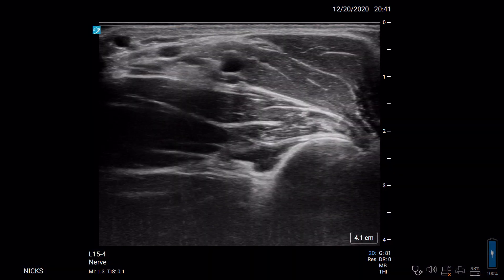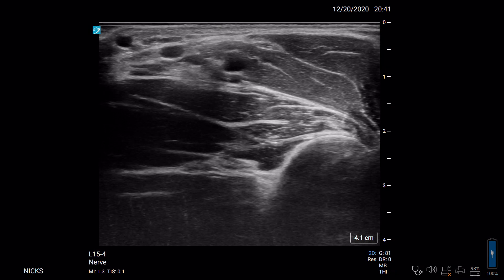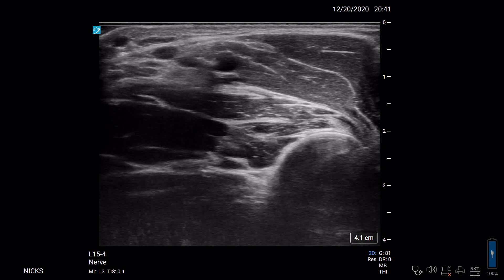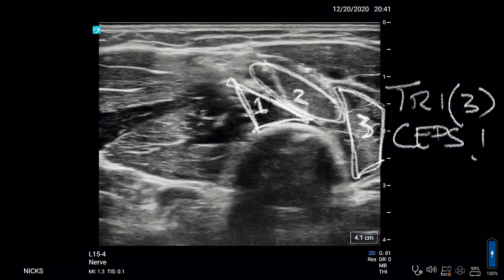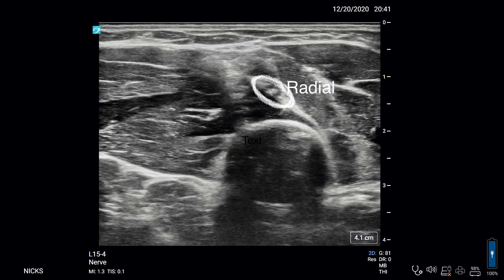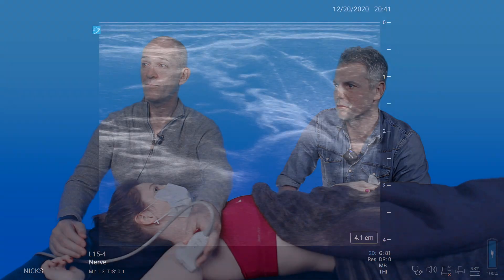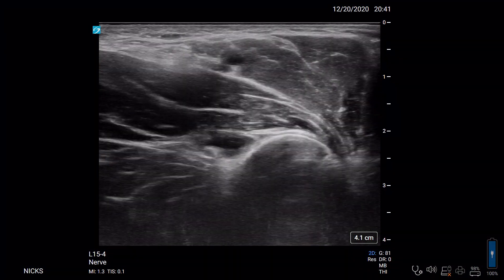I've set the depth deliberately deep here so I want to see the humerus in the bottom right corner of the screen. You can see the bony humerus and the teres major — the conjoint tendon. I call it the US Postal Eagle: it looks like the beak of an eagle going into the ultrasound screen. When I scan down I can see the heads of the tricep — the radial nerve is actually scooting down between those heads. When scanning medially and up the arm, if you see that US Postal Eagle, you are proximal enough that the radial nerve is there even if you can't see it.